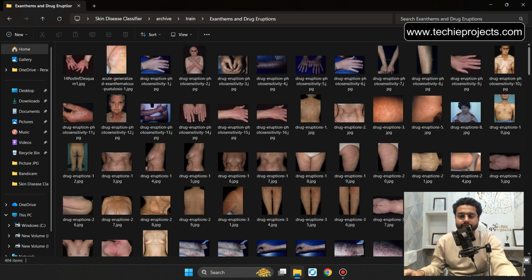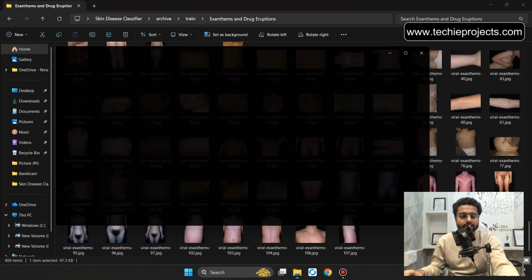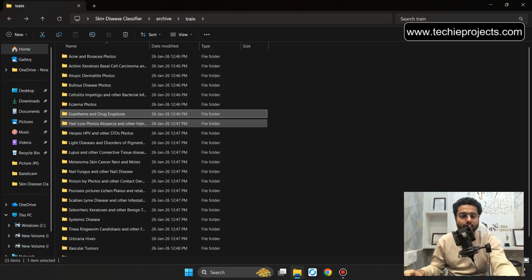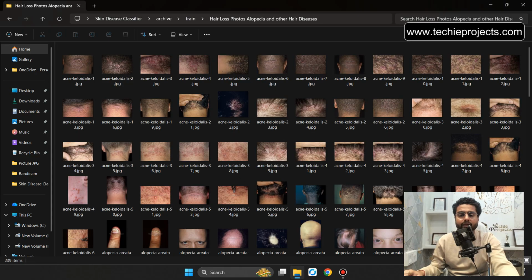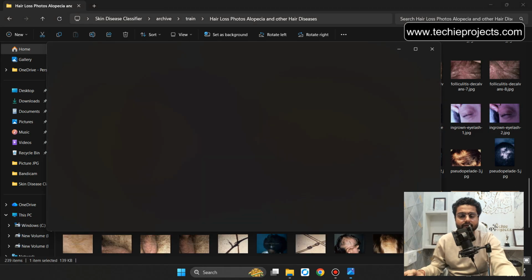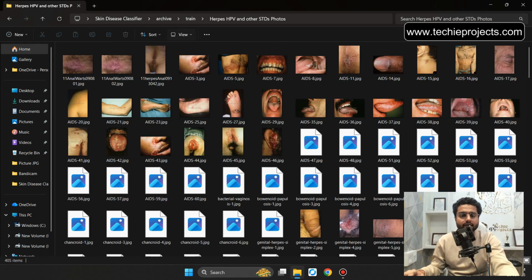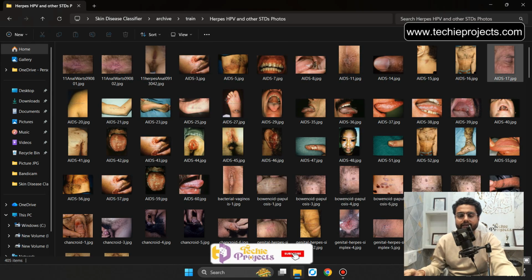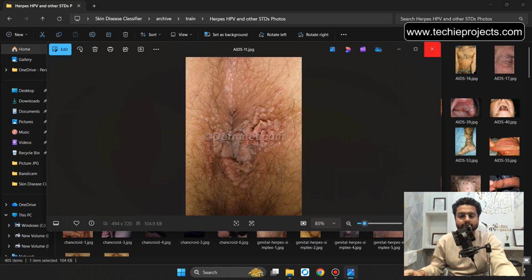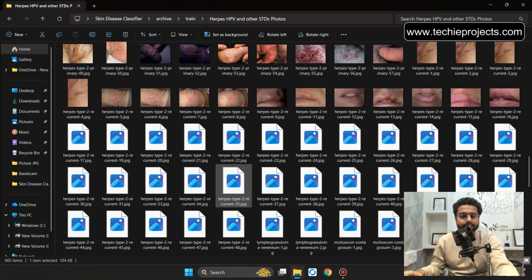Exanthems and drug eruption. It will be around 404 images. Let's open any of the images. It will be like that. Let's go back. Now open the hair loss photos, alopecia and other hair disease. It will be a type of particular hair disease. Let's go back. Now this will be the herpes, HPV, and other STDs photos. Let's open any of the images. It will be around 405 images.